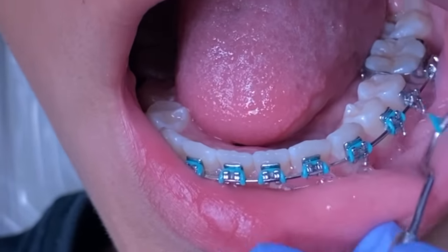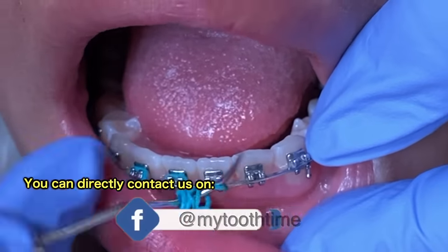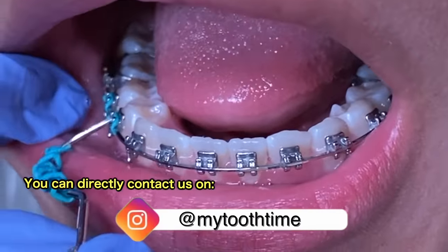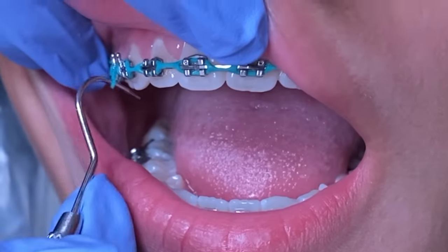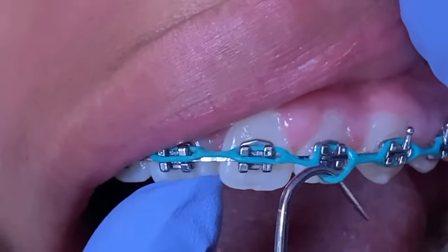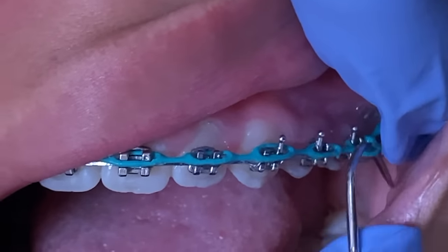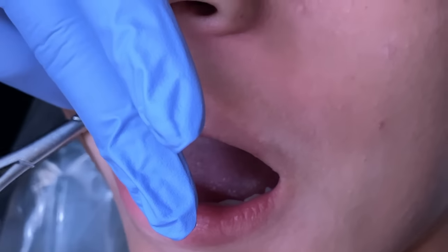Much, much, much later. So we're going on 23 months with our patient in orthodontic treatment. We've already removed the appliance. Remember, she had it on about 8 to 9 months. The reason why we're struggling a little bit is because the patient is struggling with rubber bands. Sometimes when the treatment is delayed, it's because of non-compliance with rubber bands, missed appointments, and especially hygiene as well. If you are not doing well at home brushing your teeth and keeping up with your oral hygiene, that can definitely delay the process of the treatment.